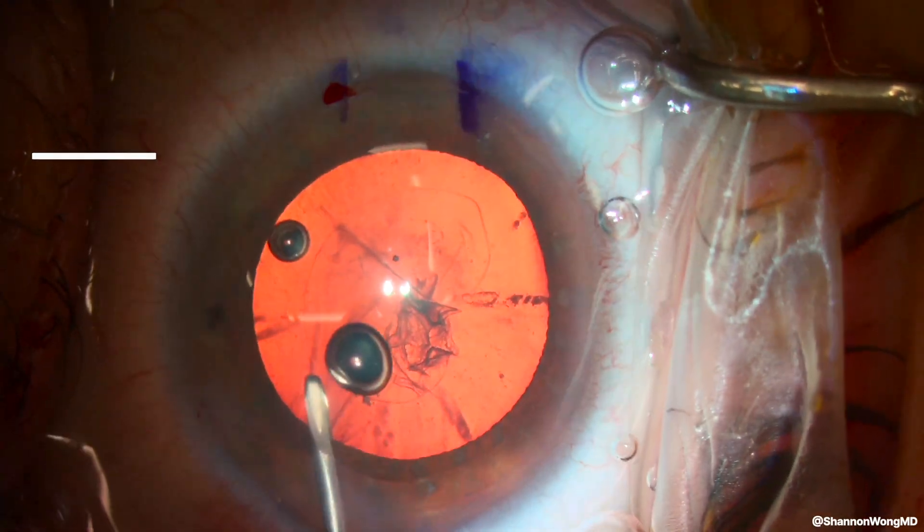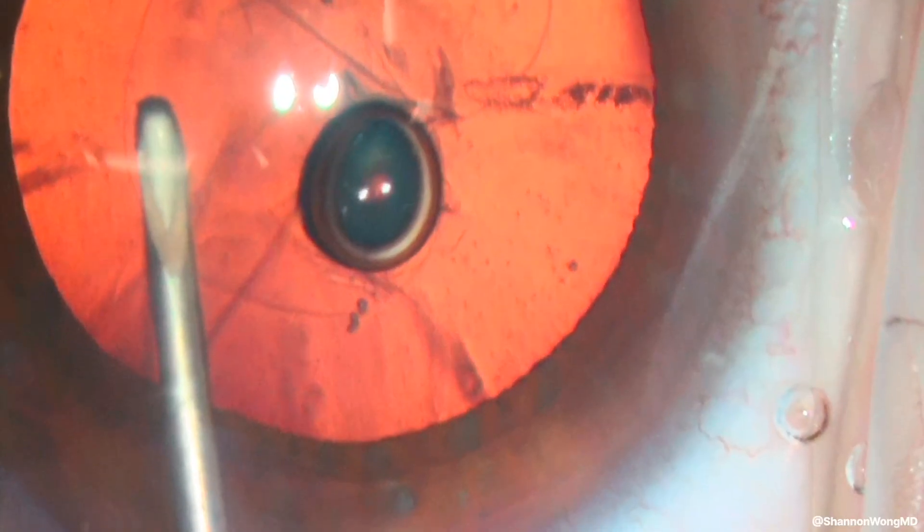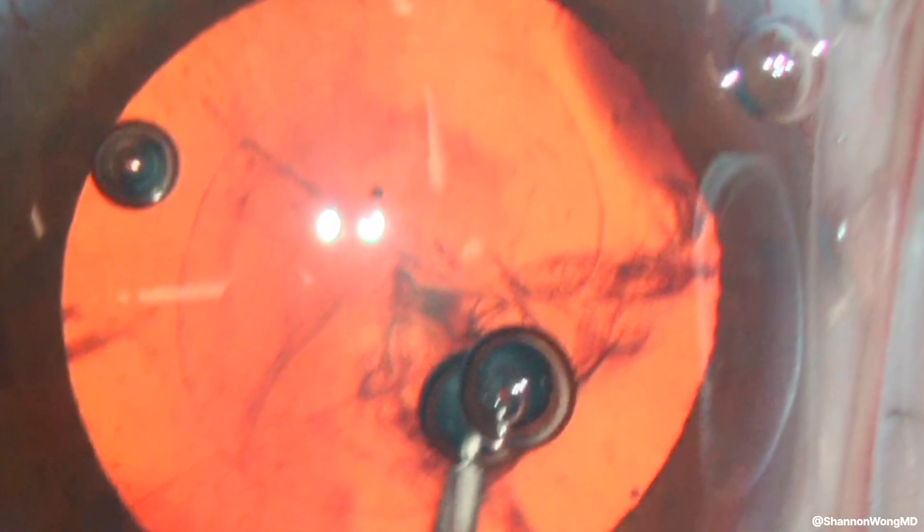Then this happens. Let's look at that again in slow motion. The cystotome suddenly moves to the right, then the left, and then cuts the anterior capsule.